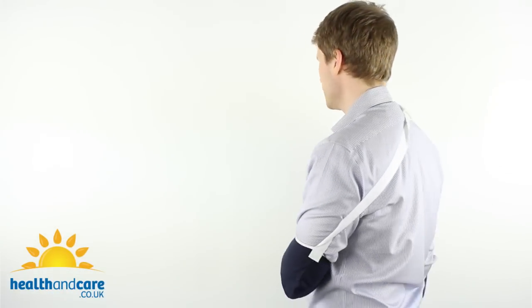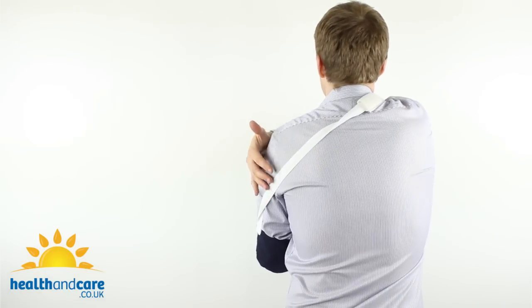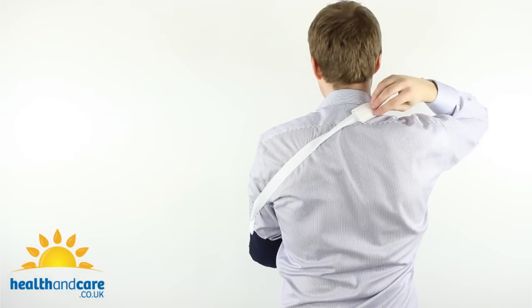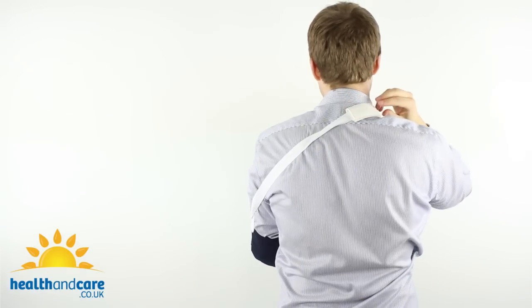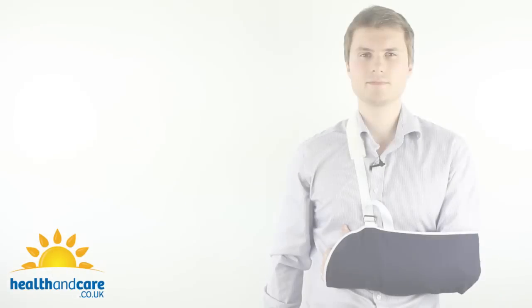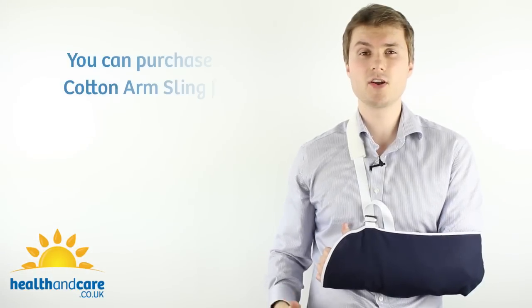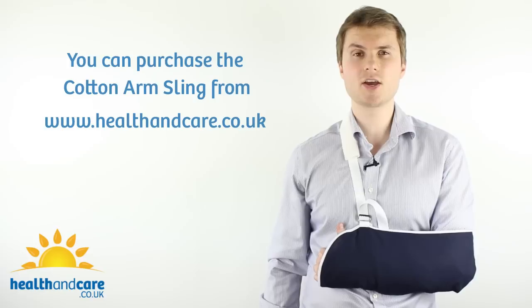The view from the back of the arm sling is like this. You can see the strap coming across the back over the shoulder, and the padded element is protecting my neck, shoulder and collar bone. The Cotton Arm Sling can be purchased on our website www.healthandcare.co.uk.